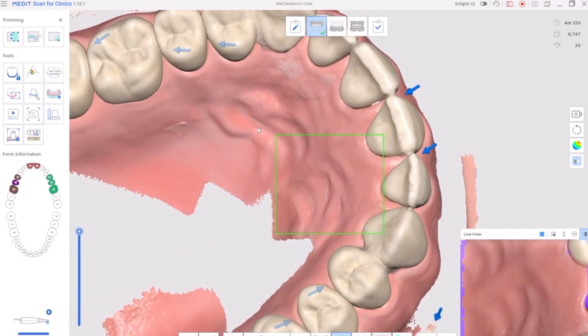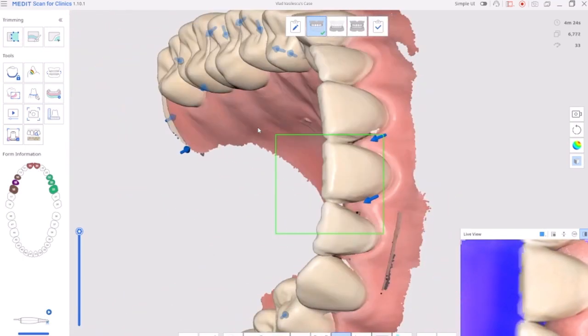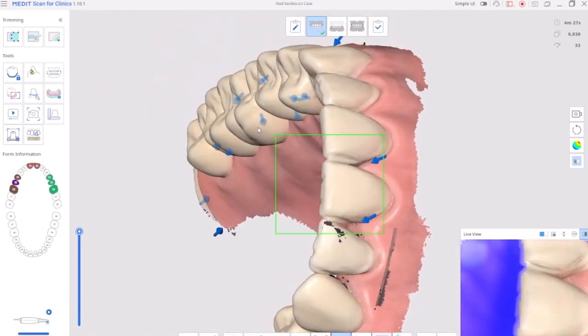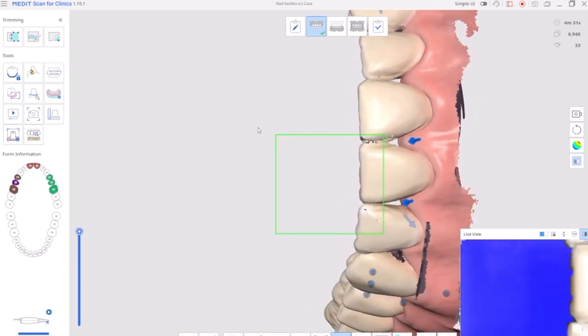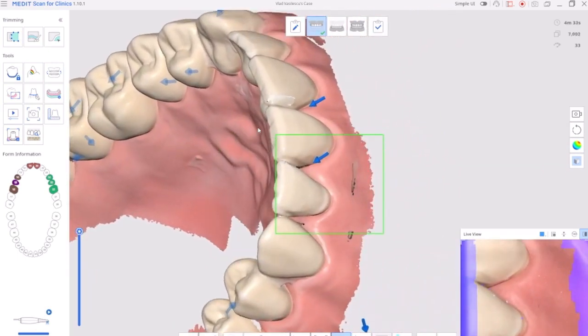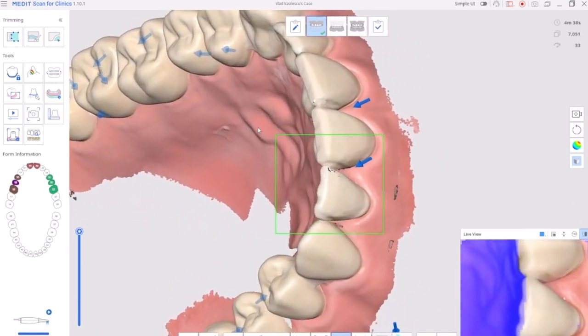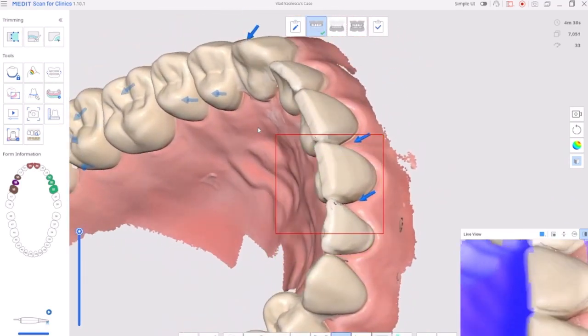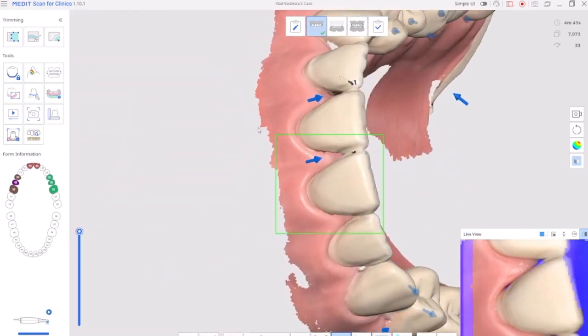It's also important not to insist too much, because if I insist too much, I will not have the right superposition of all the supplementary data that I bring in. If I scan many times, it will be the phenomenon called layering. The layers will be one over the other, and of course this is false.